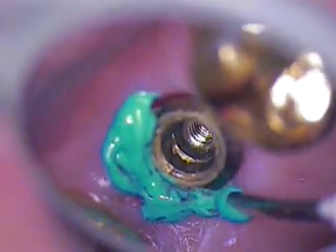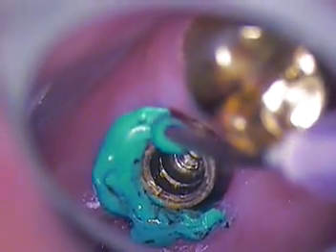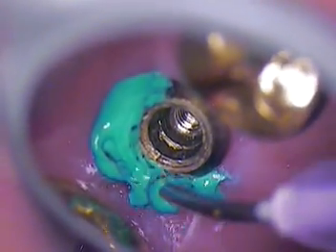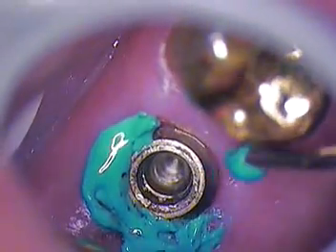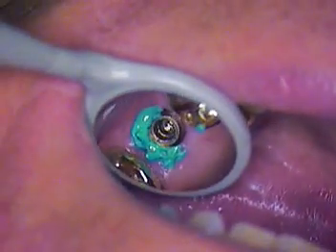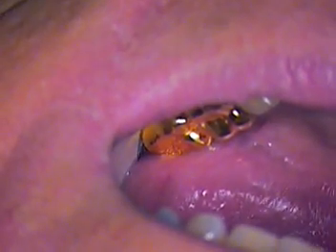All right. And we're going to let that set for about a minute or so, Jen? Okay. Right around 30 seconds. Okay. And what that'll do is it'll quiet the capillaries down, cleans it up nicely, and then we'll get ready for a final impression. So we'll rinse all that off for you. Is that okay, John? Everything good? Yeah, no problem.